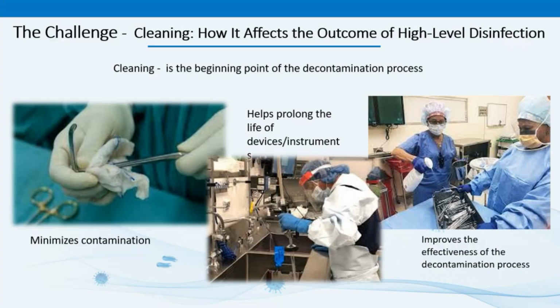Because it's so important, we need to talk more about cleaning, another of the challenges of HLD, and frankly, sterilization too. Now, many people think the cleaning process starts when medical devices are transported to the decontamination area, but in reality, device cleaning first begins at that point of use, then again in the decontamination area. Now, don't confuse point of use cleaning with decontamination that takes place later in that reprocessing process. Point of use cleaning and treatment occurs either periodically during the procedure or immediately after using the device prior to being sent for further reprocessing.